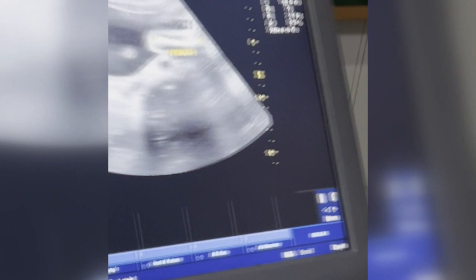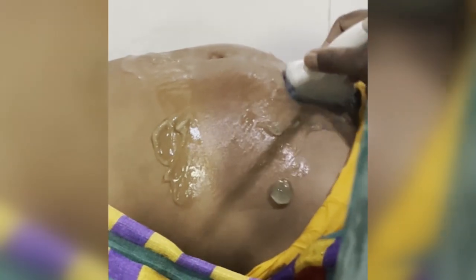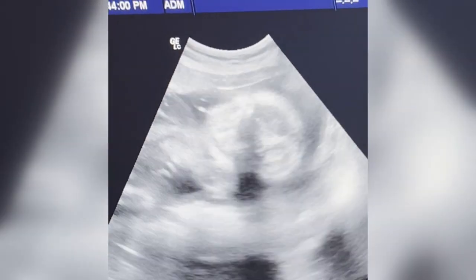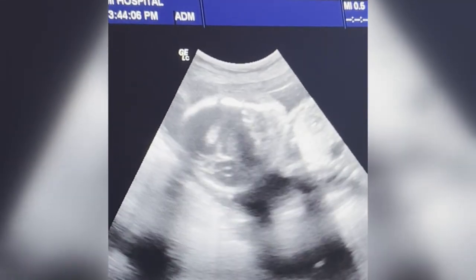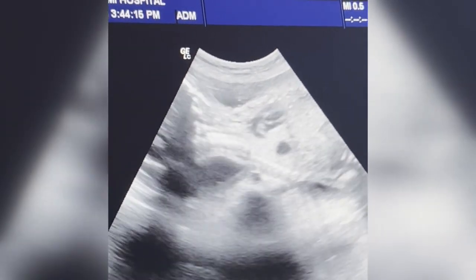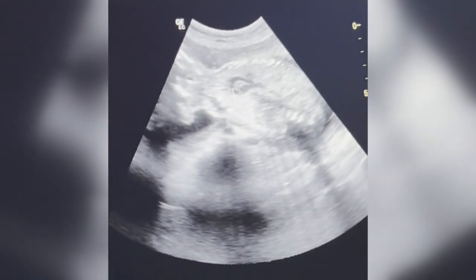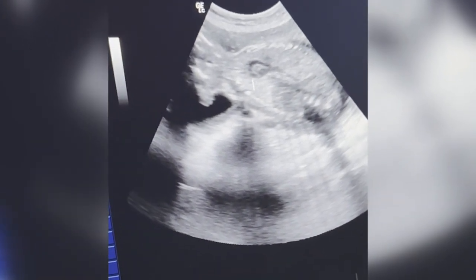Now I shall see the heart. Heart. See, heart is very nicely palpitating. Very nicely palpitating. So baby is alive. Heart. I am doing a little more contrast. Heart.